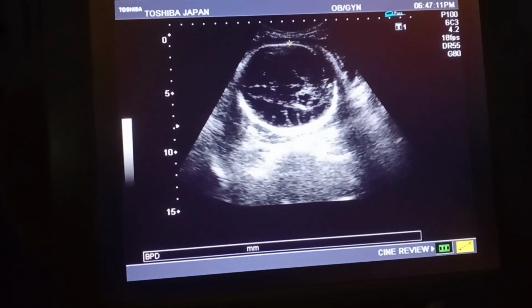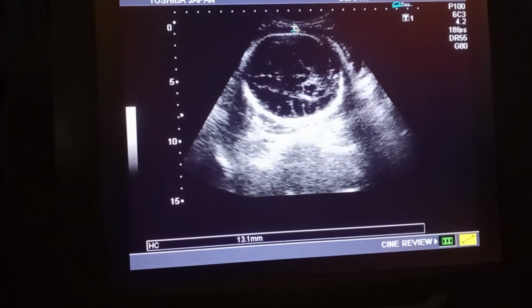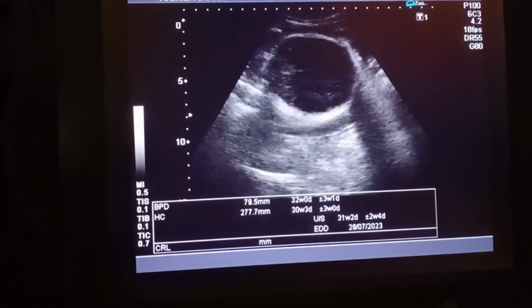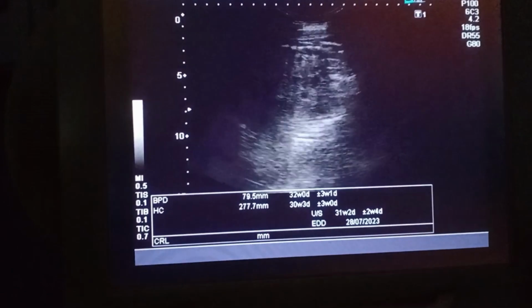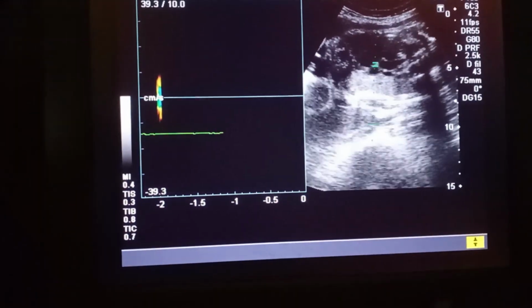Coming to the live case, this is the ultrasound of a 25-year-old female. She is having two male babies, and now this baby is female and she is very happy. I am going to focus on the skull bone at the level of the thalamus. I would like to measure the BPD and the head circumference.